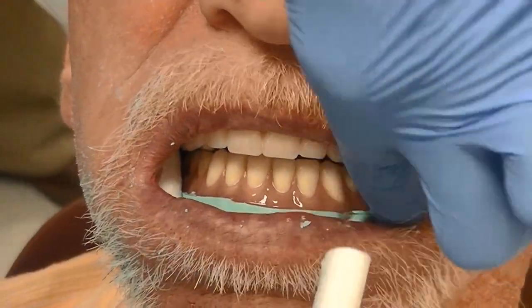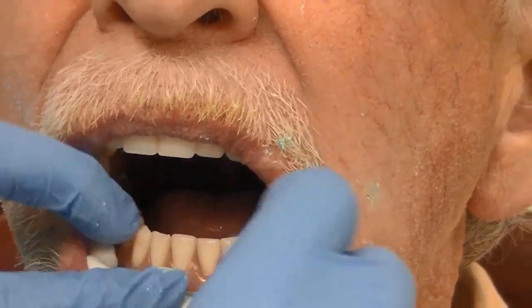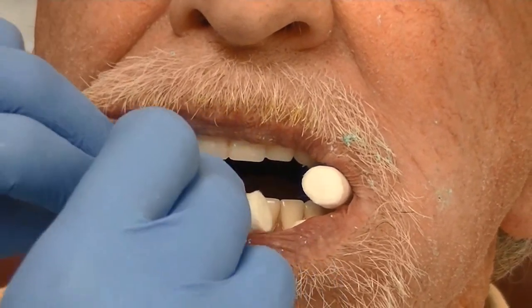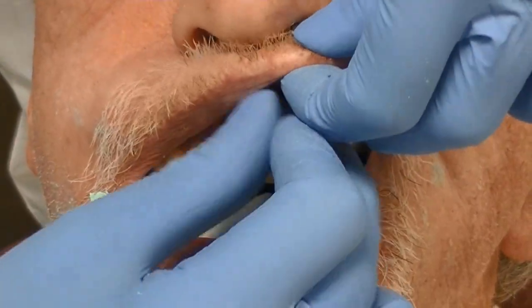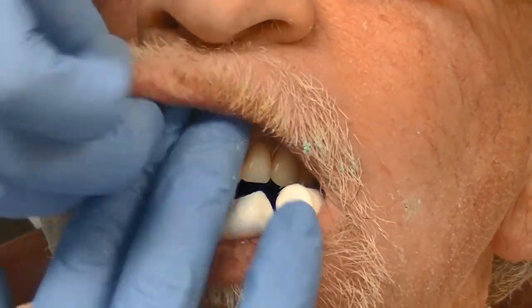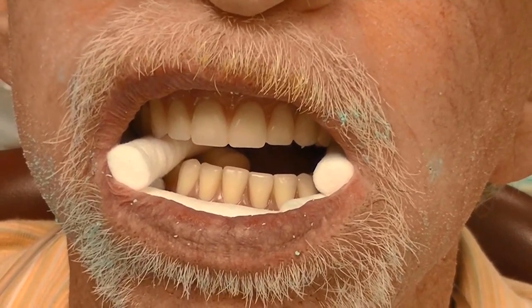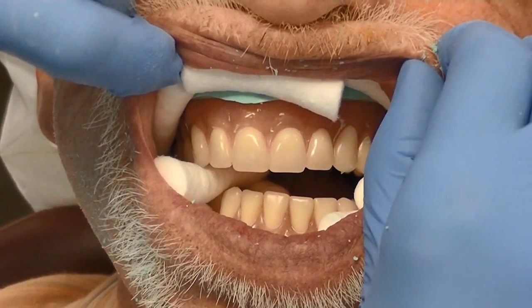Now, we want to take a series of cotton rolls, an Optragate, or plastic cheek retractors and retract the soft tissues. Placing two cotton rolls on the lingual surface verifies that the tongue is away from the borders of the denture during the CBCT scan. We take a series of cotton rolls to create an air pocket around the acrylic resin. For a mandibular arch alone, we use seven cotton rolls: two on the lingual, three on the buccal, and two on the occlusal surfaces. We want to create a soft tissue pocket around all dentures. For the maxillary arch, we place three cotton rolls only on the buccal. When the patient goes for a CBCT scan, we instruct the patient not to put the tongue at the palatal portion of the denture, but to keep it suspended between the cotton rolls.